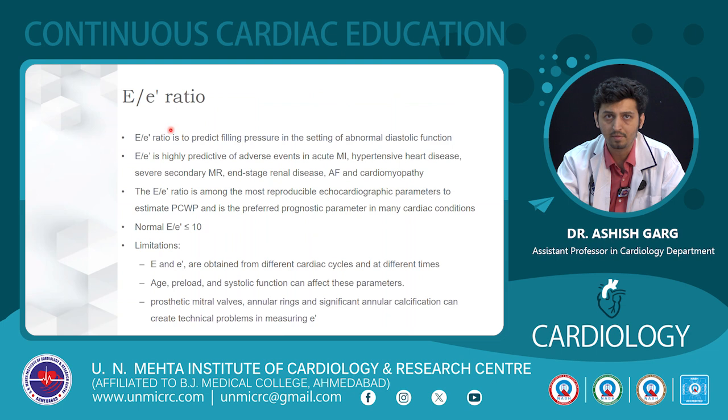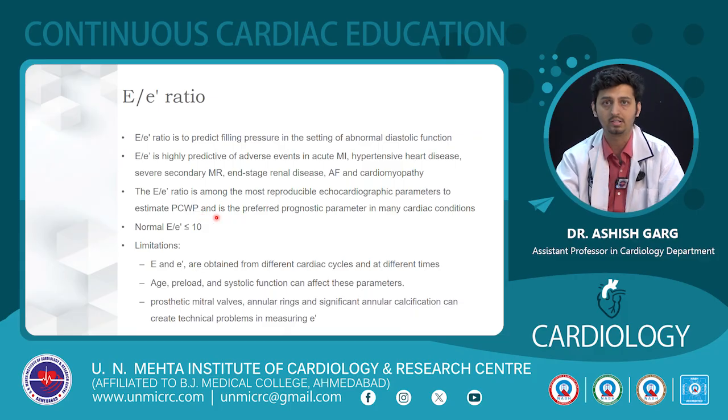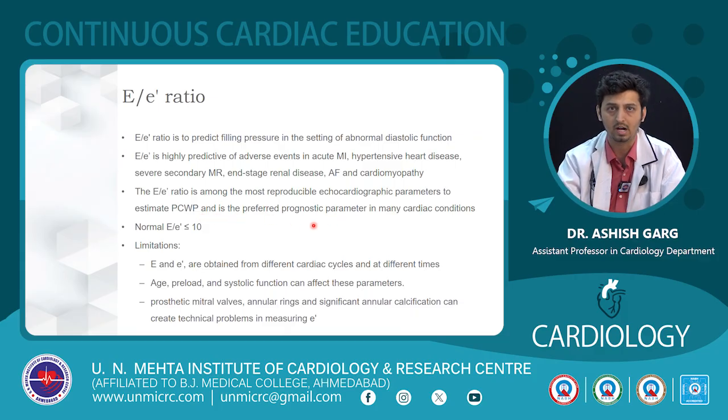The E by E prime ratio is an important ratio which predicts filling pressure in the setting of abnormal diastolic function. It is predictive of adverse events in acute MI, hypertensive heart disease, end-stage renal disease, AF, cardiomyopathy, and it is one of the most reproducible echocardiographic parameters to estimate the capillary wedge pressure, and is the preferred prognostic parameter in many cardiac conditions. The normal E by E prime is less than 10.